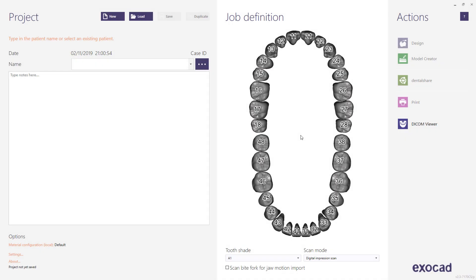This video tutorial from ExoCAD will show you all the features in Chairside CAD which can be used to design an anatomical crown.